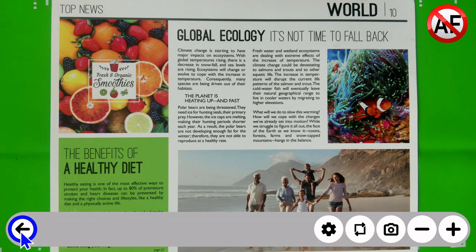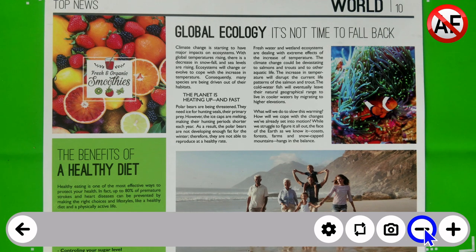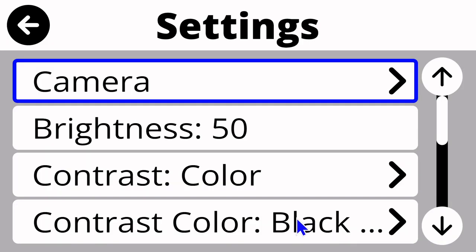In the lower left is the back arrow that will take me back to my main carousel. And then in the right, plus sign to zoom in, lower right. Next to it to the left is a minus sign to zoom back out. Camera for capture, a couple of arrows interlocking to rotate 180 degrees. And then I have my settings gear wheel, which I'm going to go into very quickly here before I show you taking a capture with my camera, just to remind you of the settings that are available in here.